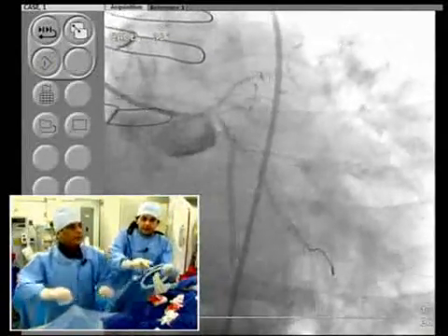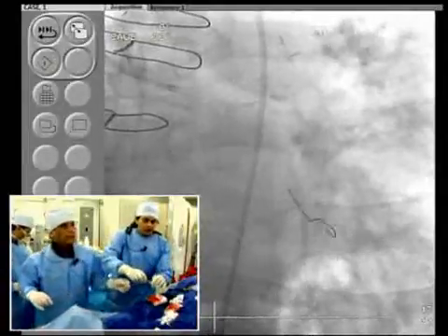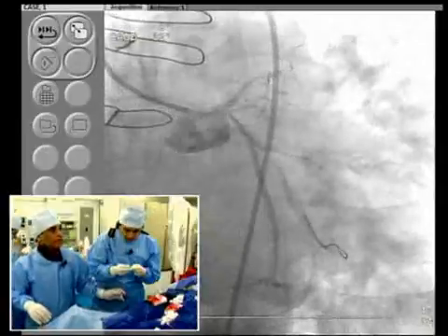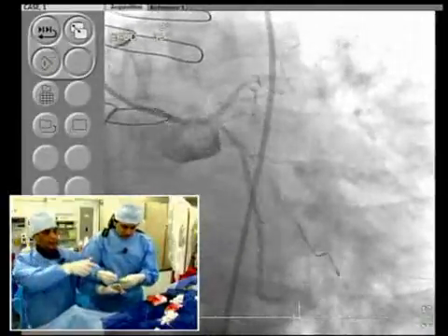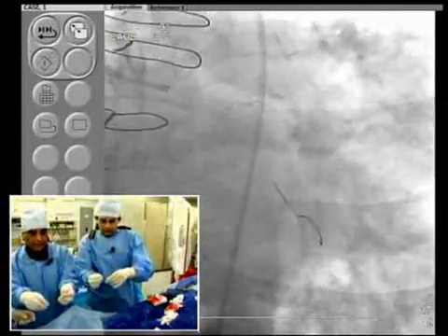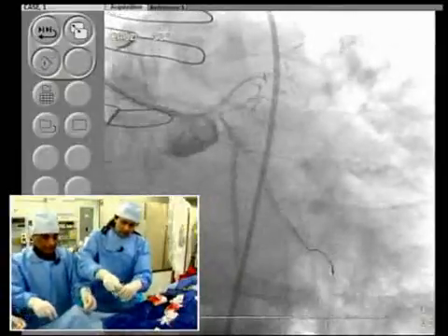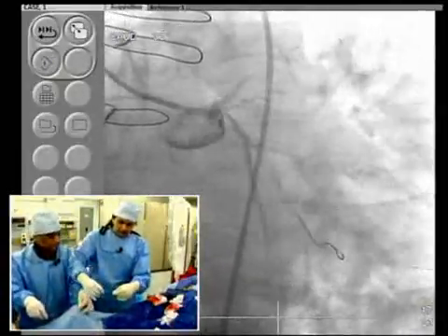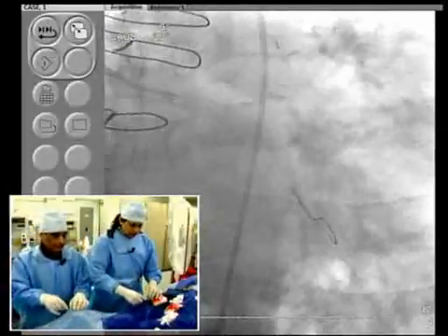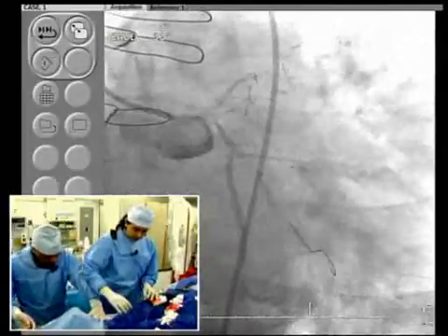The only question is, in that unfortunate situation of having a distal dissection, then you would. No, but what we'll do is, if necessary, we can go through the stent struts, because we saw the proximal. You know what, it may not be bad in this particular case: you do a stent, secure your OM, and then go through the stent struts and open the distal circumflex. Or we don't need to. Yeah. You can place it just before the distal circ and OM. Okay.